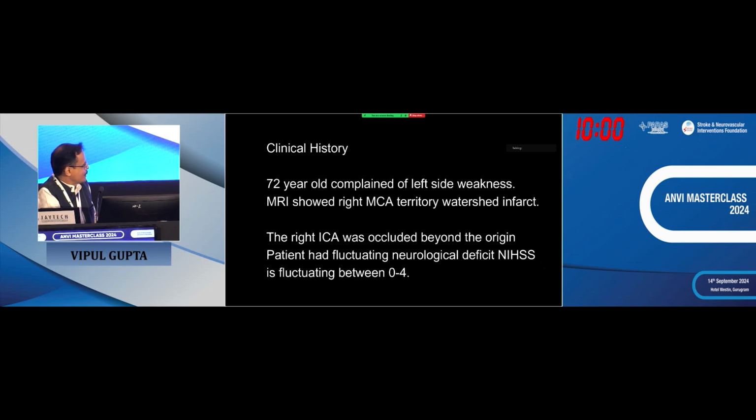So when you have already crossed that and you already got a very good access and the patient was 3.5 hours, this patient was 3.5 hours with a very good ASPECTS score, you may argue, why do you not want to keep that artery open? Because you know when you come out, you're going to lose that artery. And that's what has happened. So I take your point, but I probably would have landed up putting a stent there.